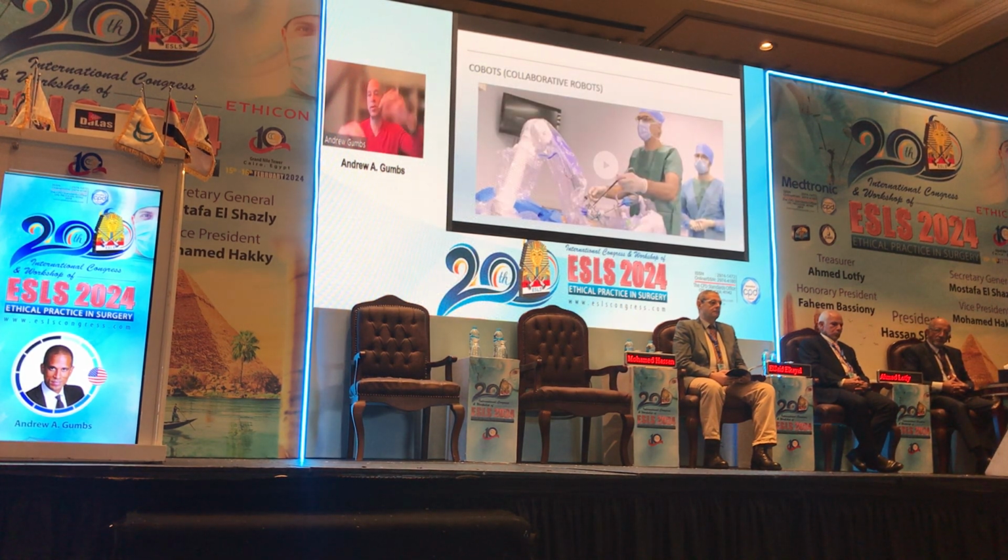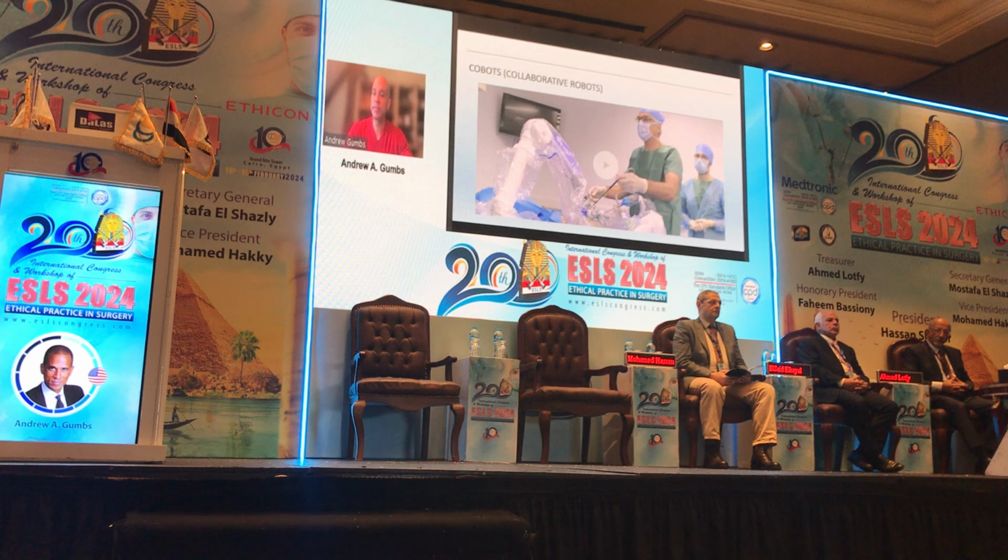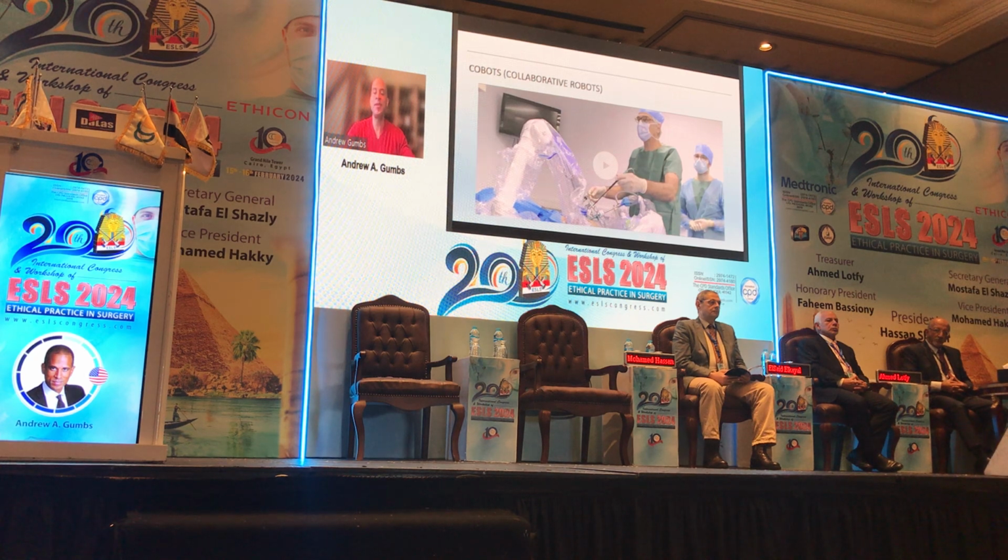It has 2 robotic arms assisting the surgeon, one holding the camera, one holding the retractor. The surgeon's at the bedside, maintains haptics. Now you can imagine the Jamie system, where you have 7 degrees of freedom, and robotic arms supporting those 2 surgical instruments. You can have a very powerful device. It's obviously cheaper, there's no console, and again, you maintain haptics. Maybe this would be the best way to get more autonomous actions in surgery.